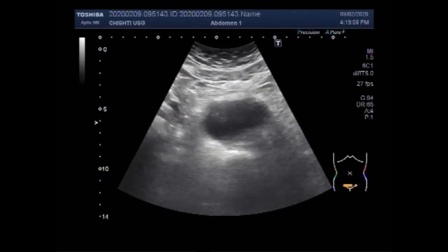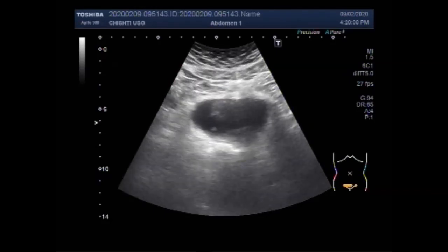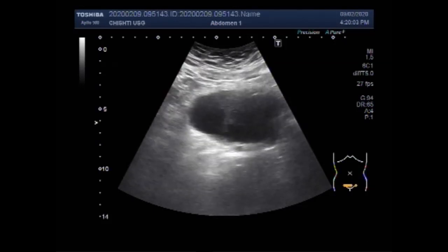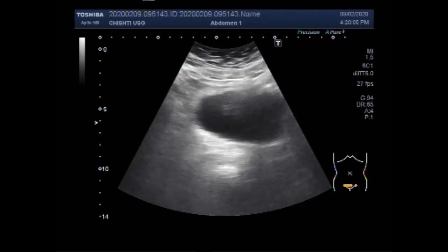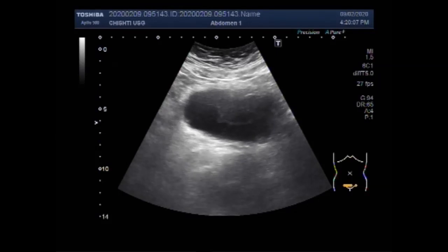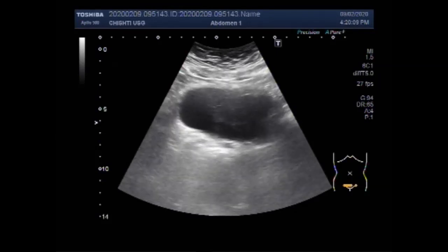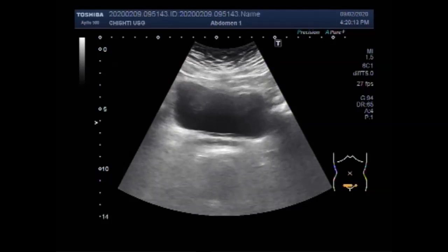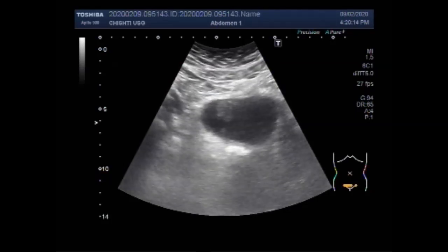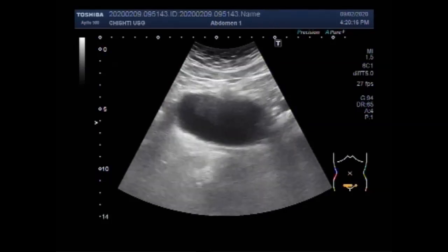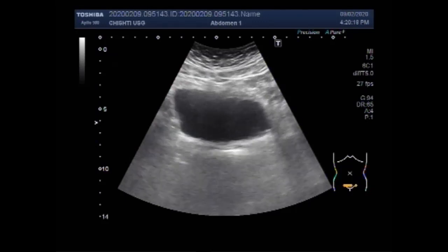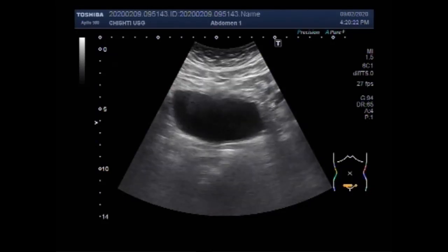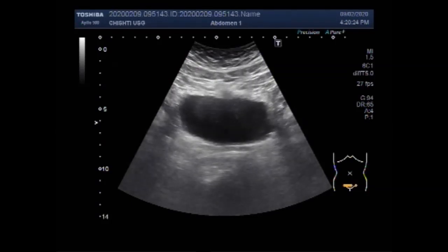You can see the urinary bladder having a mass in the upper portion of the urinary bladder, and the mass is seen along the roof of the urinary bladder.